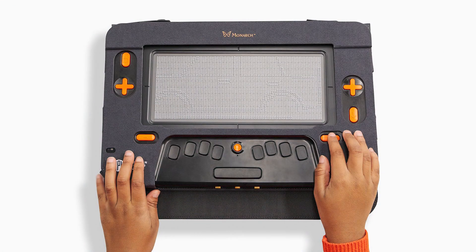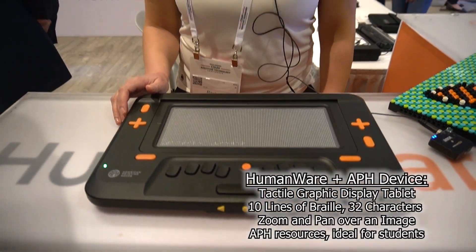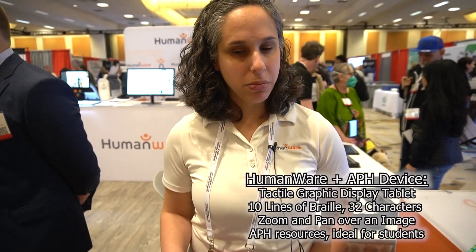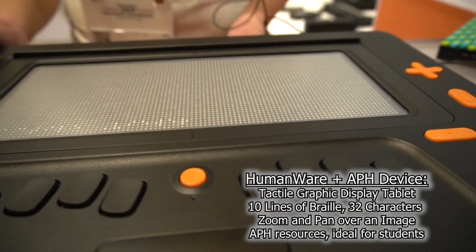TechConnect back on the floor here at CSUN 2023. We had to stop at the HumanWare booth for the new Monarch tactile display. We have Rachel. So the Monarch is the collaboration between APH — American Printing House — and HumanWare. This is a braille display and tactile tablet: a multi-line braille display with 10 lines of braille and 32 characters per line. This allows you to read multiple lines of braille and view tactile graphics — a device that brings those two together. You can zoom in and zoom out of images, and pan the image around to see just the portion you need.